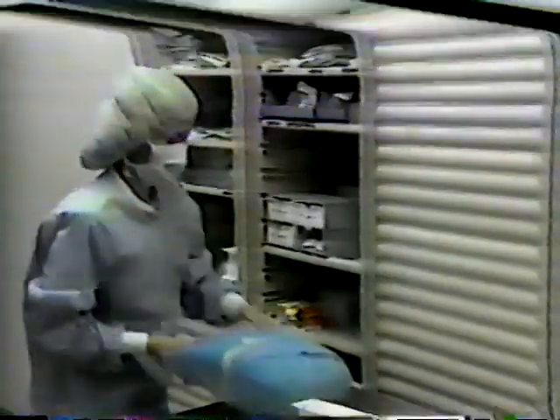Sterile items are kept in closed storage located in appropriate areas. These instruments and supplies may be packaged in a variety of materials, which can be reusable textiles, non-woven fabric, plastic, or hard containers. Packaging material must allow sterilizing agents to penetrate its contents, while providing a barrier to environmental microorganisms.